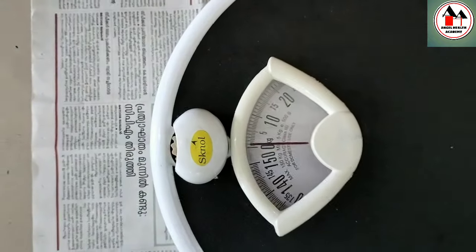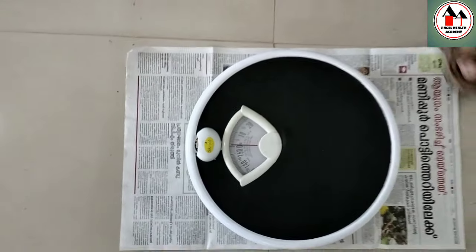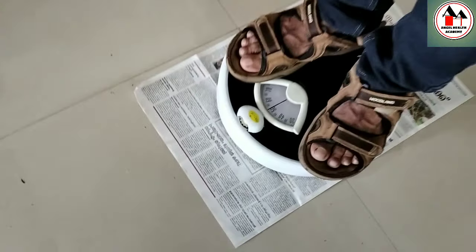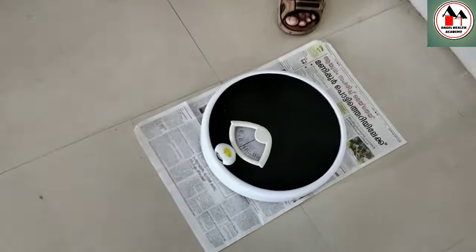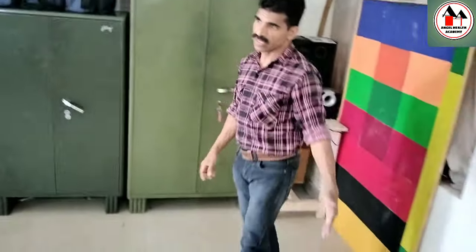After setting to zero, we will get an accurate reading. Before asking the client to stand on it, you should test the machine yourself — stand on it and verify that the reading matches your known weight, so you can confirm the machine is working correctly.